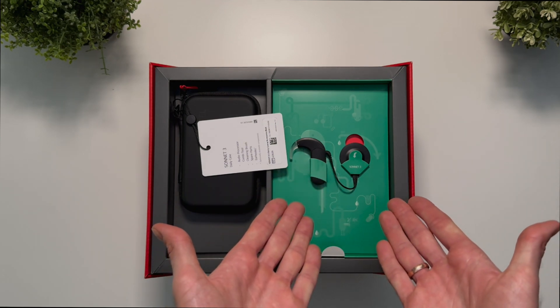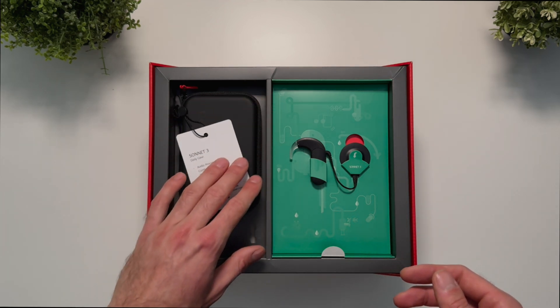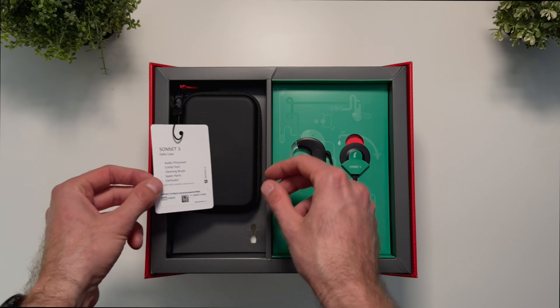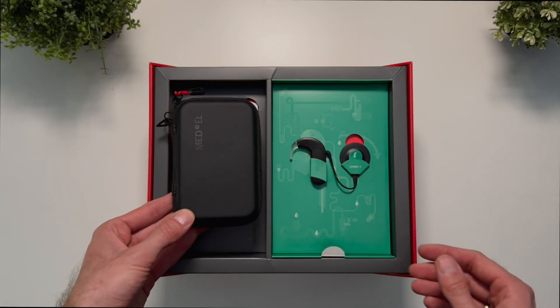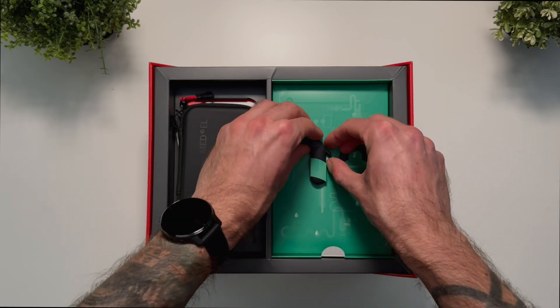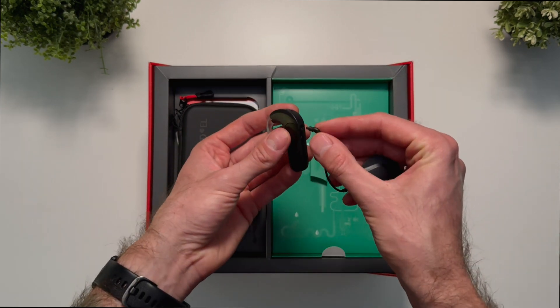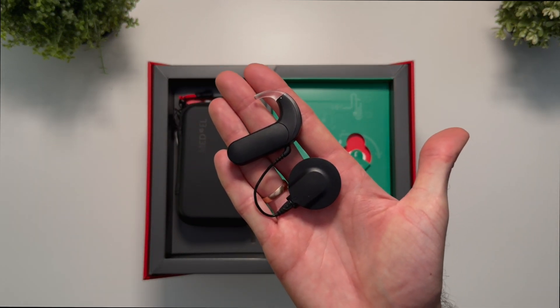After opening the box we see the Sonnet 3 audio processor and the accessory case. It's the same case as with the Sonnet 2. Ladies and gentlemen, it's the Sonnet 3.